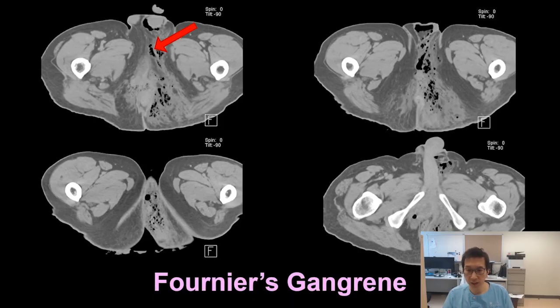And so here again, it really shows the power and the utility of having radiology available. If you did not have a CT scan, this man may have had two ways of management. One, which is a wait and see approach and give antibiotics. And the second may be just to take him to the operation theater and do an open procedure, an exploratory procedure, just to look for whether there's an infective focus around the perineum.